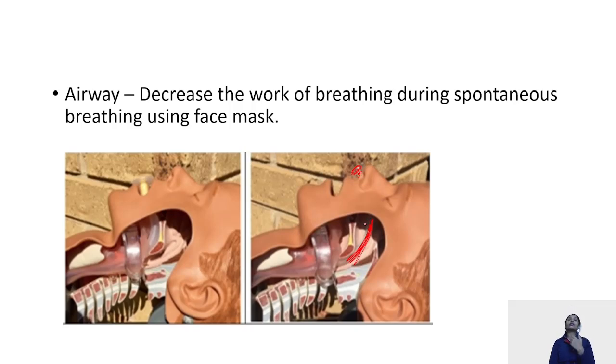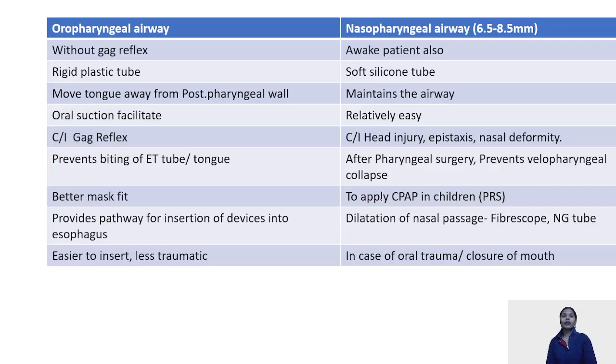The disadvantages of using the nasopharyngeal airway are that it can lead to bleeding or epistaxis, or it can form a focus of infection. Done. But the biggest advantage of using the nasopharyngeal airway is that it can be used in awake patients also, unlike your oropharyngeal airway.